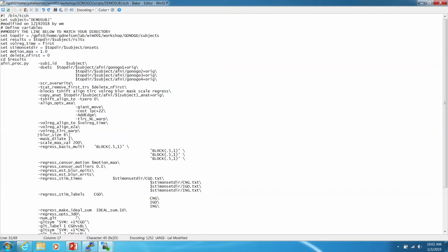The byproduct of that is it reduces the noise, but it also reduces the specificity of the signal, because when you see this amount of activation in this little cube in the brain, you know that some of that is from the surrounding information. So we lose a little bit of our ability to say this is exactly where this activation occurred. However, it allows us to actually find our signal amidst the noise in the brain. So that blur step is very important.